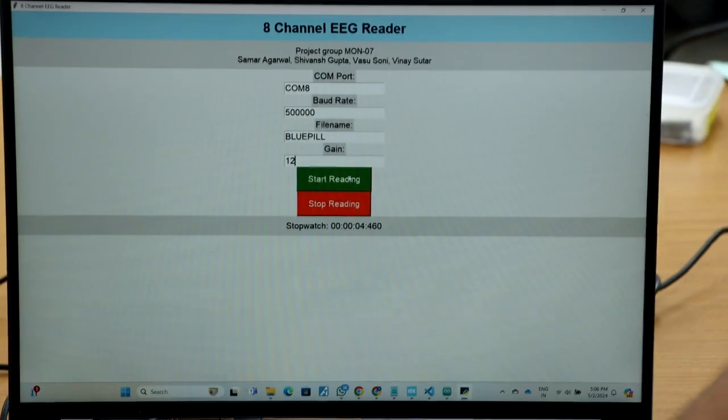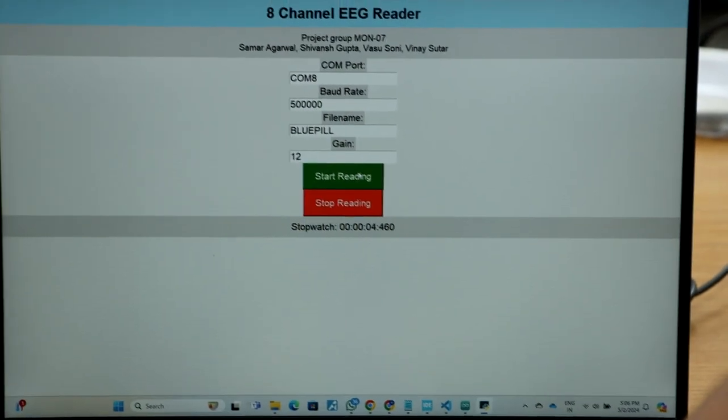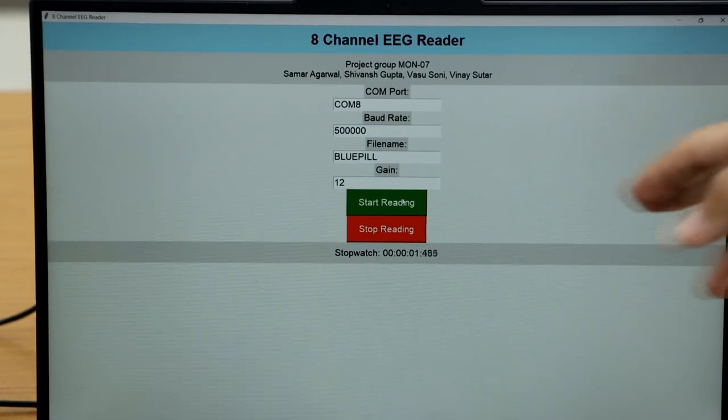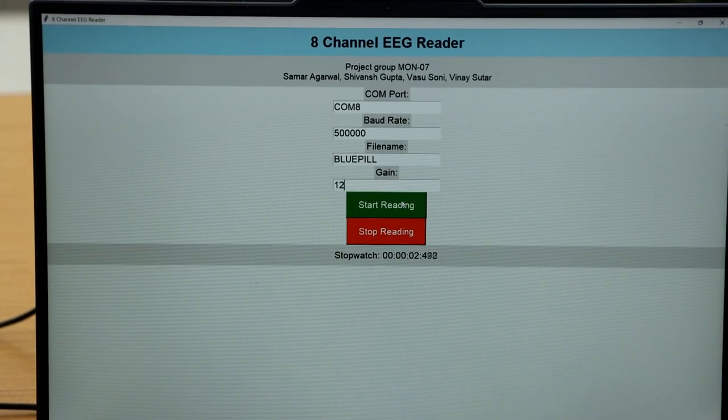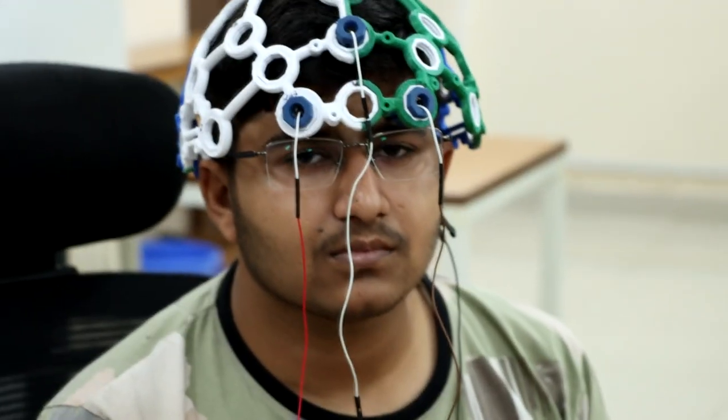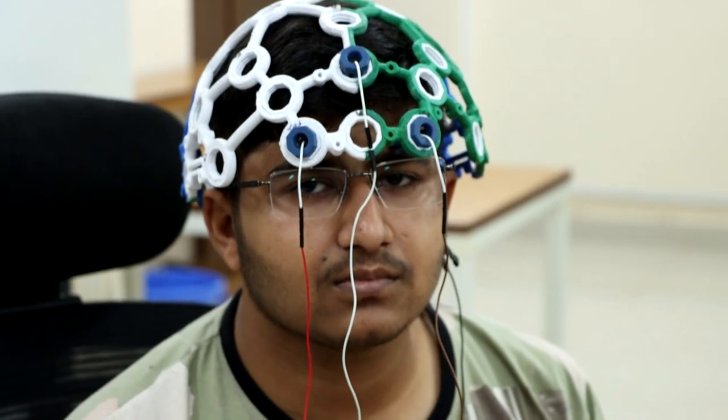Now we'll do a test. I have pressed start recording and the subject now blinks his eyes as you can see.